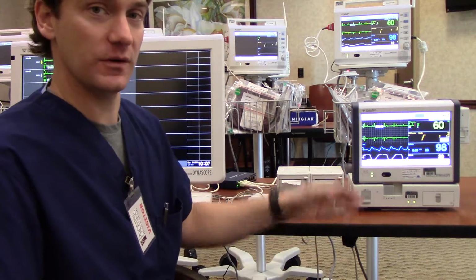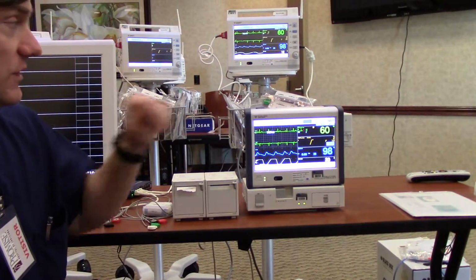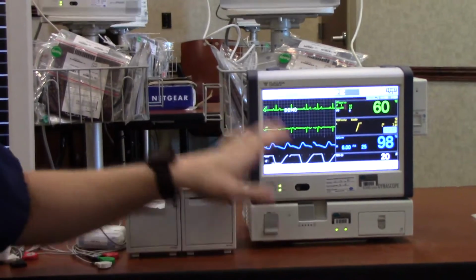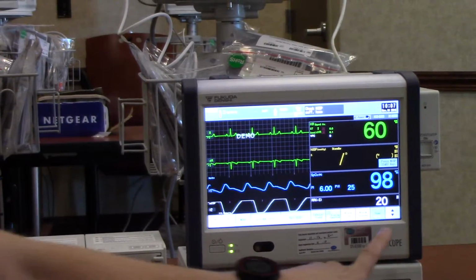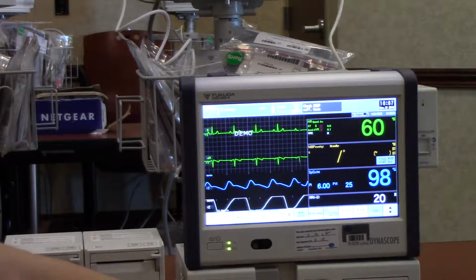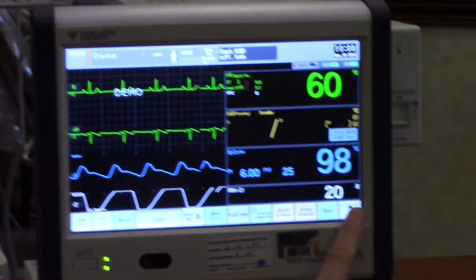Okay, I'm going to be going over your new bedside monitoring device here, the 8200. So these are going to be bedside in your ICU. As you can see, we're a touchscreen monitor. We've brought forward 2 rows of user keys. In order to toggle between the user rows, pressing the arrow key here in the corner, you'll be able to find the user key you're looking for.